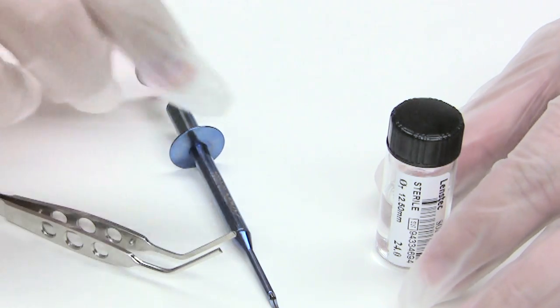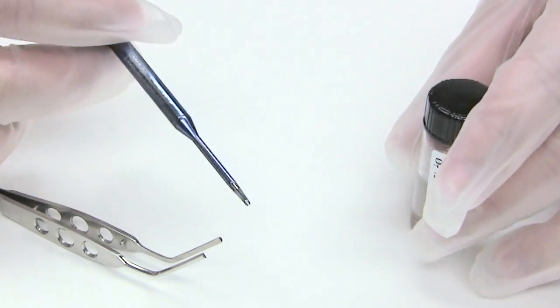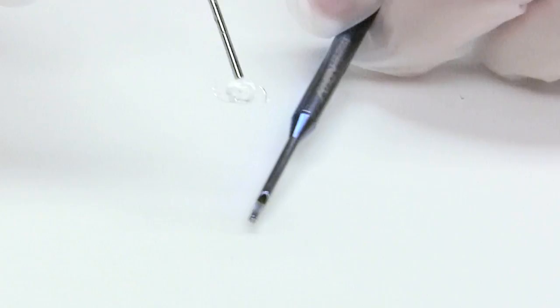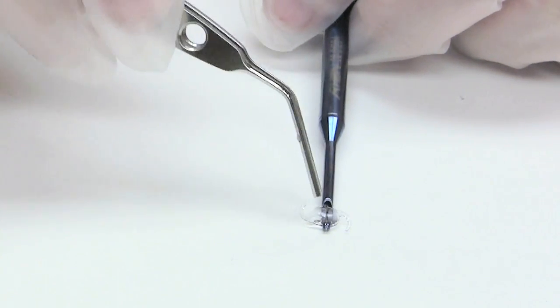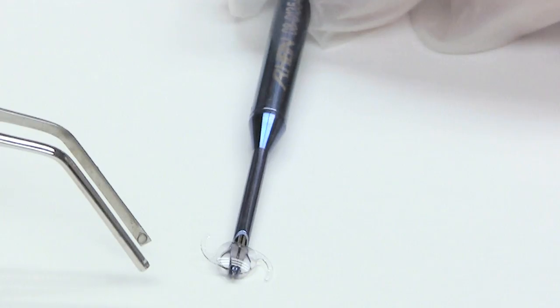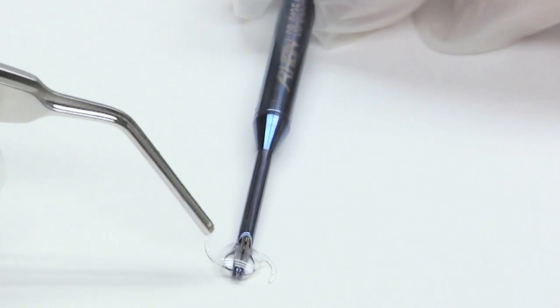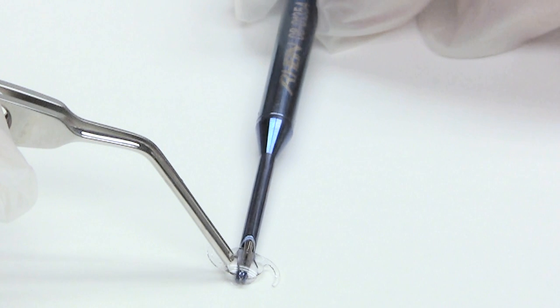To use the instrument, you'll stick it through the main incision, make sure the lens is prolapsed out of the bag, and you'll go back and you'll see there's a slight curve here. You'll go back and capture the back part of the lens.